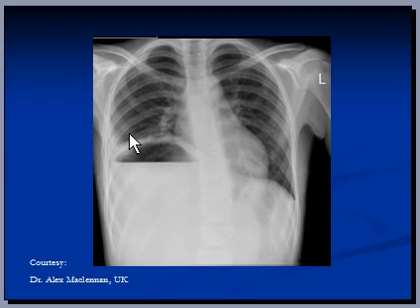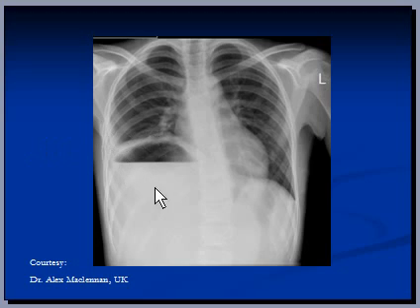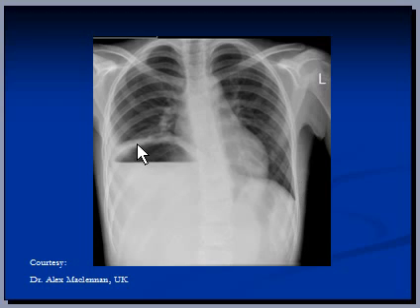Number two: the right costophrenic angle is not clearly visible and is blunt. This is the left costophrenic angle and is very clearly and nicely visible here. But the right one is blunt, which raises the possibility of a small pleural effusion in this area, or also possibly small atelectasis, which is collapse of lung tissue.